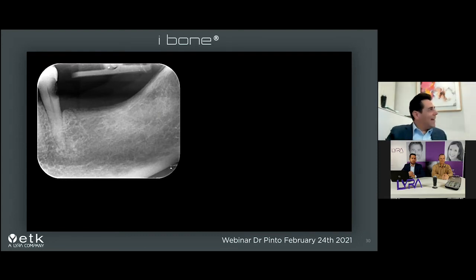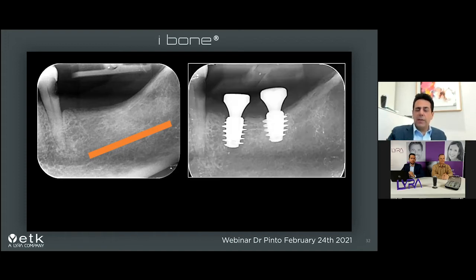Sorry. And if we see the position of the mandibular nerve, it is not giving you enough height. And if the patient doesn't want a bone augmentation and wants to reduce the surgery, or is afraid of bone graft or bone regeneration, we decide to put a very short implant. You see this implant is only 6 millimeter in length and 6.2 for the large part of the spire.